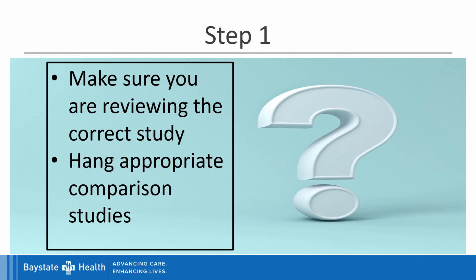Make sure that your hanging protocols are set up appropriately so that you have your new study in the same location every time you look at an examination. For instance, if you are reading chest x-rays and by convention you have the new study on the left screen and the old study on the right screen, make sure that your hanging protocol is set up that way, but also ensure that you check the dates and times of each study so that you don't inadvertently interpret the wrong study, assuming that the hanging protocol has gotten it correct.